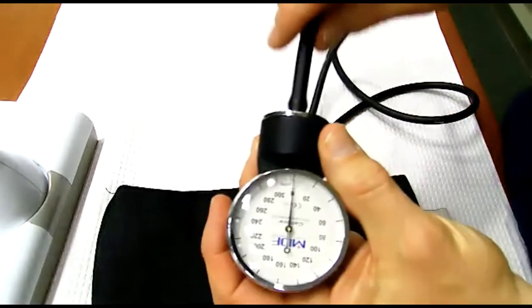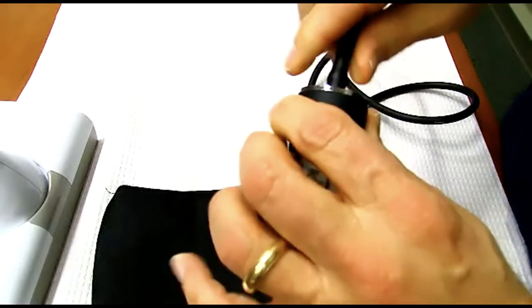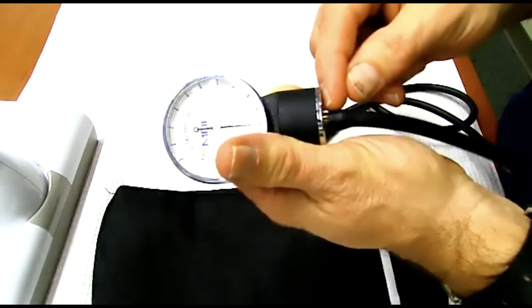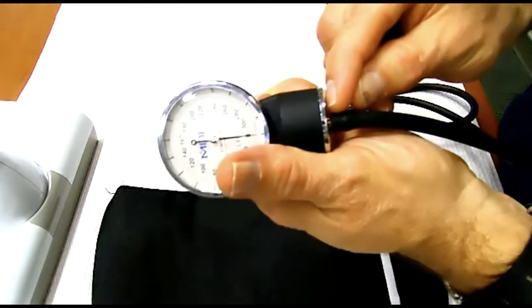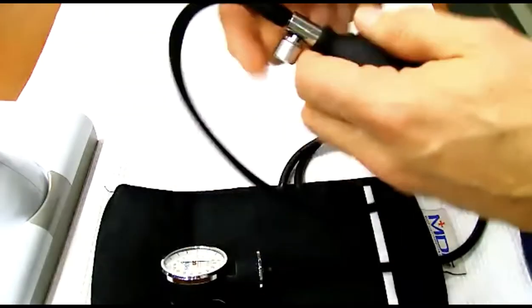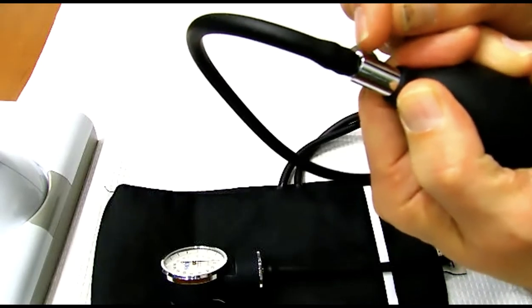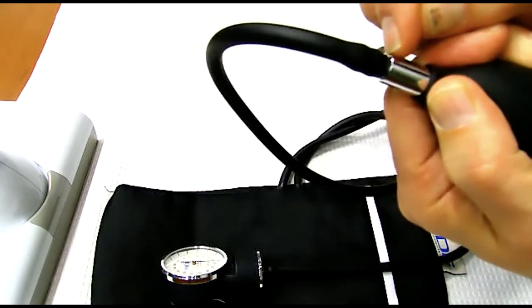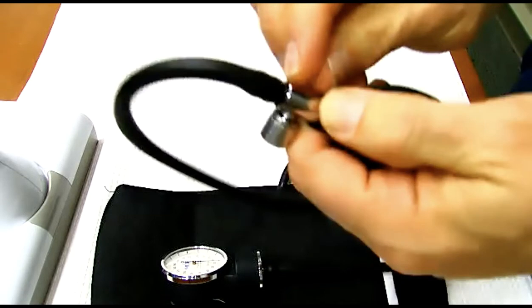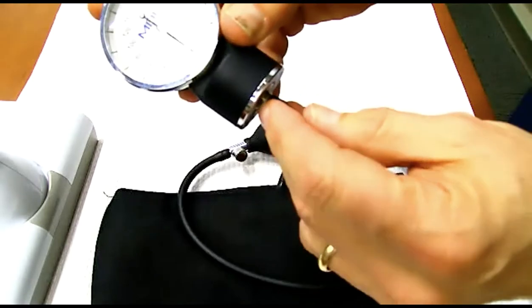What I need you to do is take the rubber part here and push it over the little valve stem. There really should be almost no gap between the end of the tubing and where you're putting it. In this case, there's a little bit of screw threads on the bottom of the manometer, so there's a little gap there. Then take the tubing and push that onto the bulb valve. This takes a little force, but you'll notice there's almost no sliver between the hose and the bulb valve stem. So push and push and get it over that little stem, until the rubber is basically touching the rubber thing. That should be the same with the manometer, even though a little bit of the screw threads stick out.